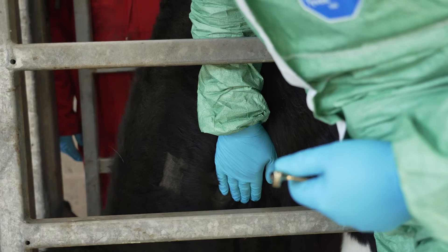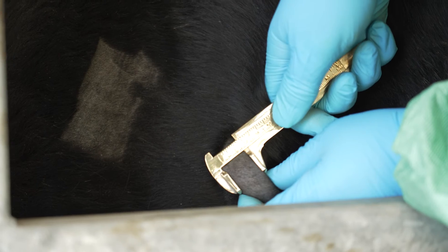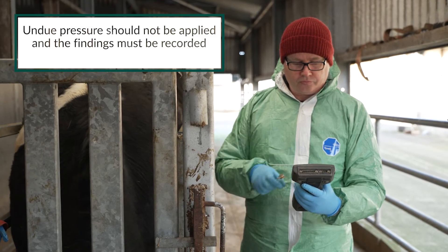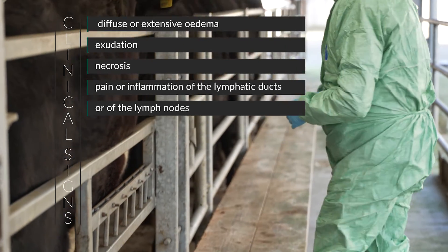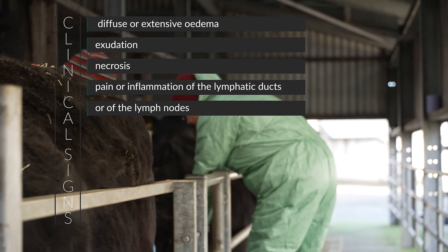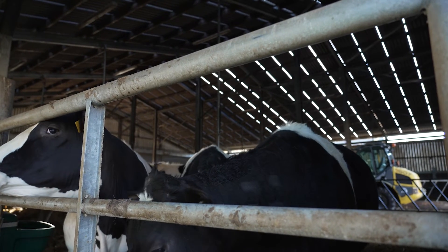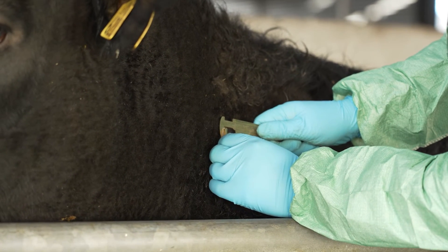Each injection site must be examined, palpated, and measured. Measurements must be taken carefully by placing the calipers across the broadest width of any reaction present; undue pressure should not be applied and findings must be recorded. All measurements should be rounded up to the nearest whole millimeter. Clinical signs such as diffuse or extensive edema, exudation, necrosis, pain, or inflammation of the lymphatic ducts in that region or of the lymph nodes associated with a reaction to the tuberculin must be recorded. The presence of any of these signs at the bovine tuberculin injection site is always indicative of likely tuberculosis infection, and animals showing such reactions must be deemed positive irrespective of the measurements recorded. Reactions without associated clinical signs are described as circumscribed.